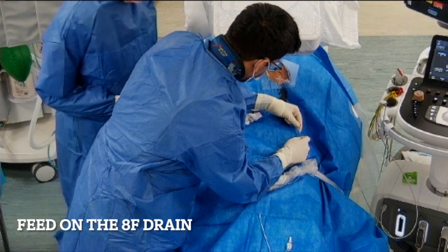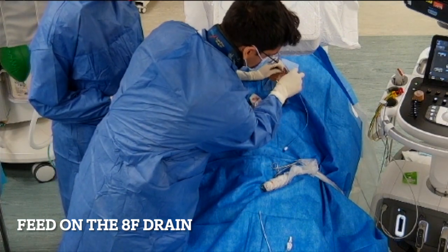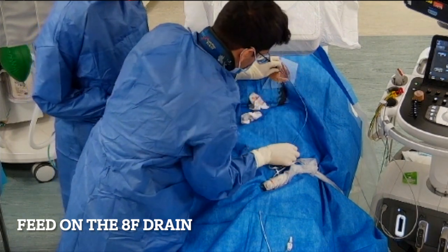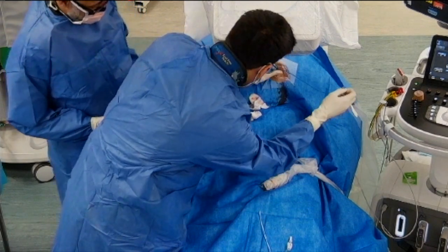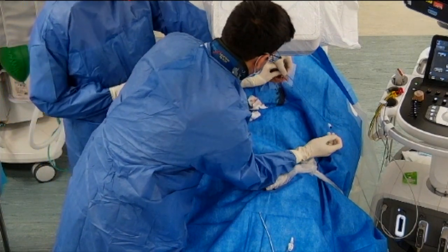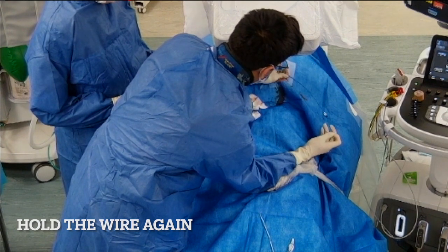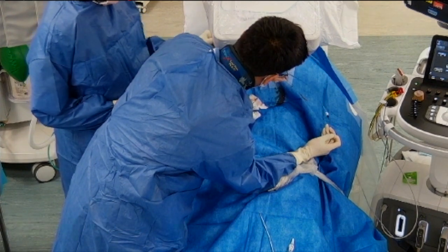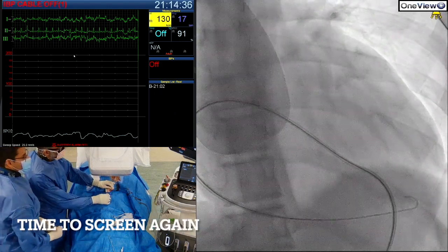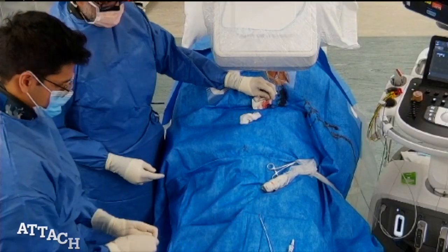We then feed on the pigtail catheter drain, which has several holes at the end. We never let go of the wire — there's a generous length inside the pericardium, so Chet feeds it back slightly to get a good grip again at 90 degrees to the skin. With tension on the wire for support, he slowly advances the drain forward with minimal resistance. We screen again and confirm the drain has gone all the way into the pericardium.